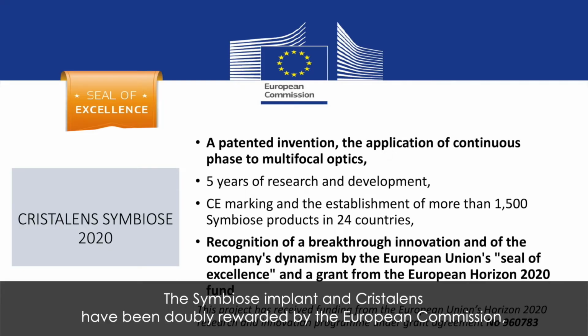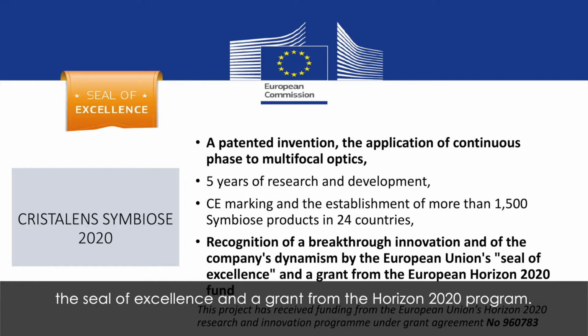The Symbiose implant and Cristalens have been doubly rewarded by the European Commission: the Seal of Excellence and a grant from the Horizon 2020 program.